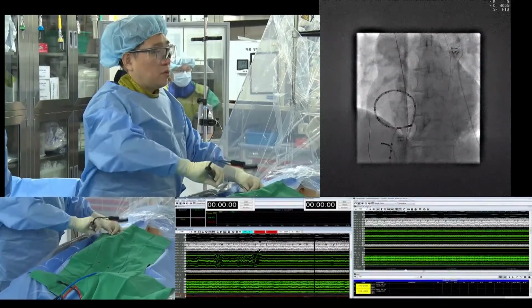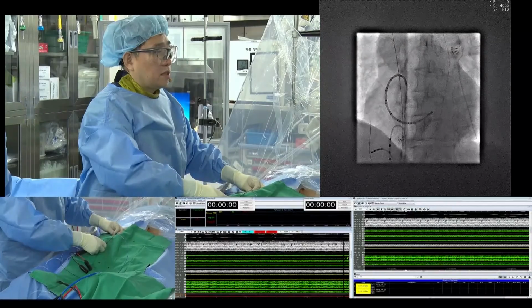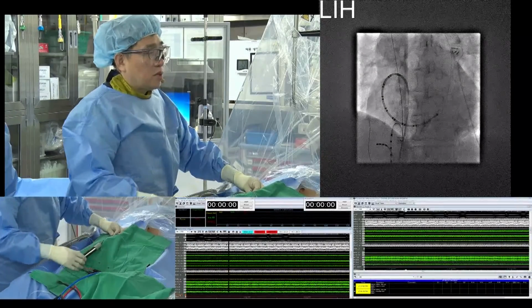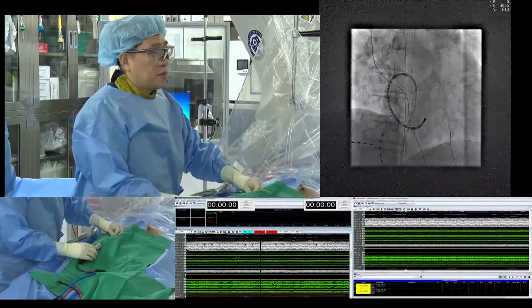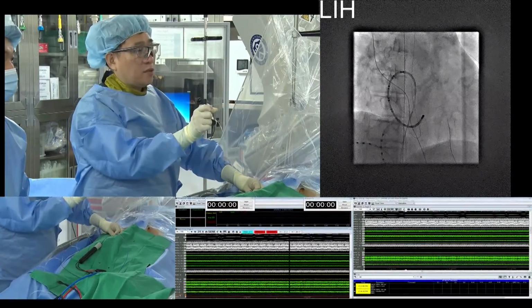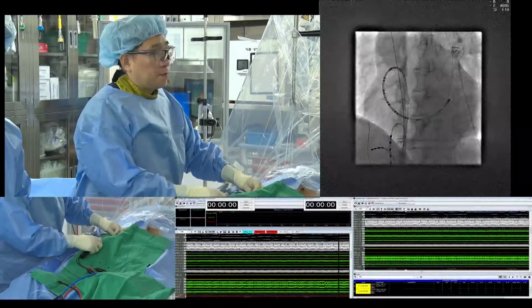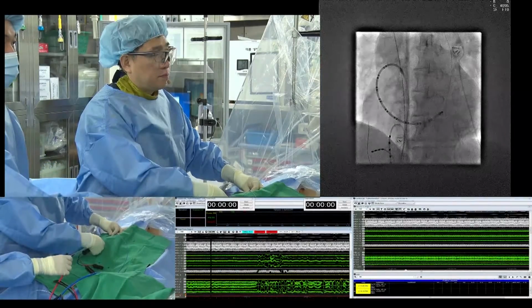And luckily, our catheter is already inside the coronary sinus, and gently push little by little, and you can check whether the catheter position is proper or not in the RAO view. And you can imagine the coronary sinus location in the RAO view. You can make sure of the CS position by the distance between the vertebral body anterior aspect to the coronary sinus ostial area.